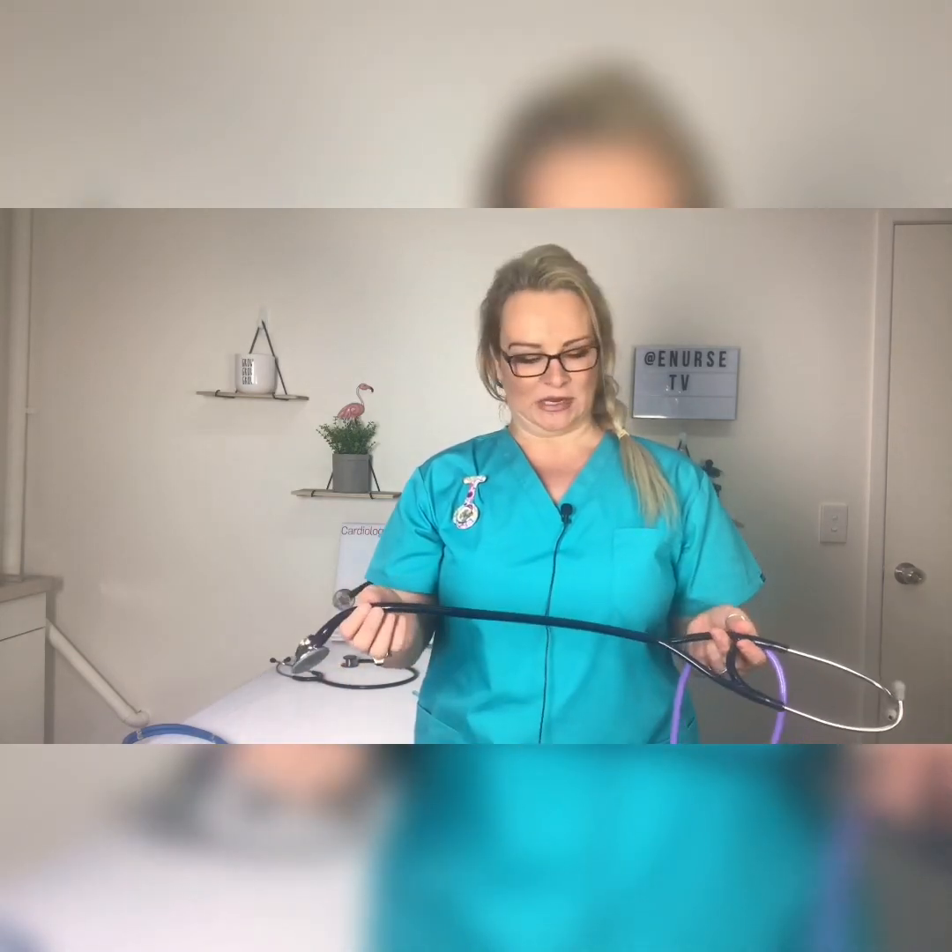Others are categorized by the age of the patient — paediatric, neonatal, adult and so on. And then the most common classification is cardiology, like this one, or regular, which is just your normal dual head.